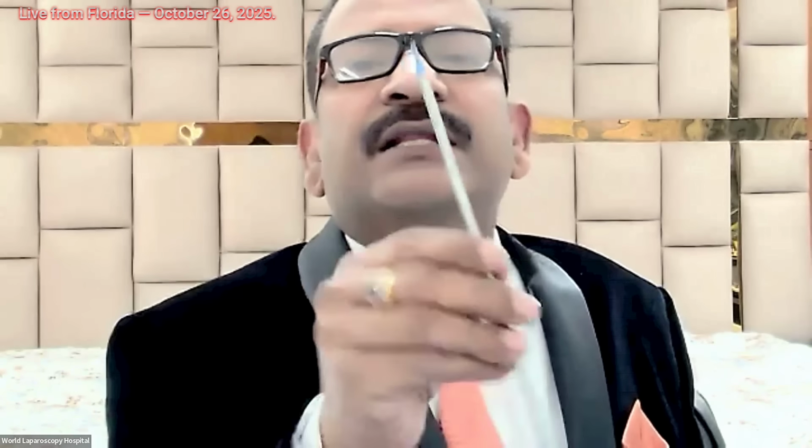So this is the bipolar forceps. After that, this is the bipolar hook. You can see here there are two hooks, and in between there is an insulation. If you see carefully, in between there is an insulation. So basically there are two hooks together and current only travels in between the jaws. And on the back again you can see there are two connectors.